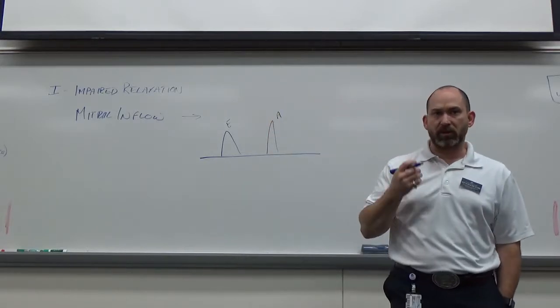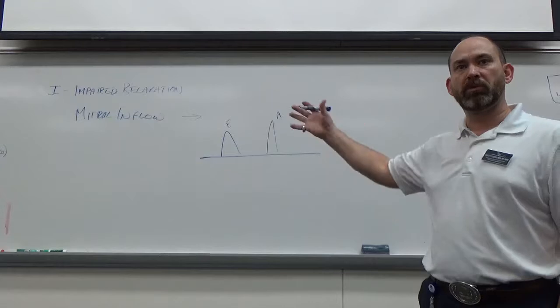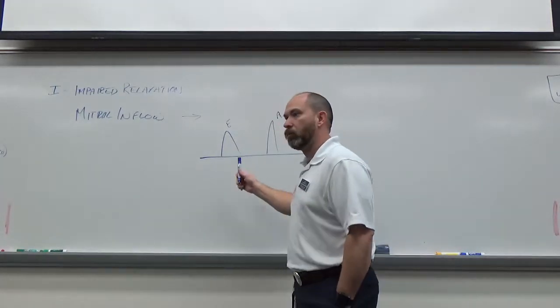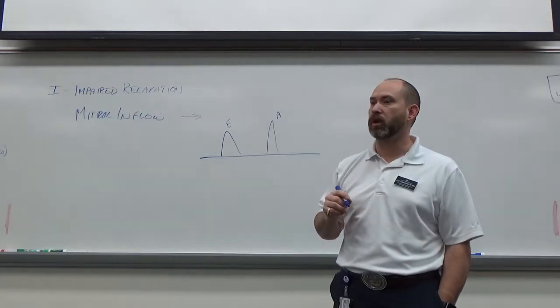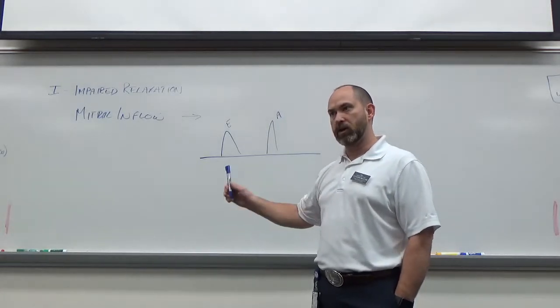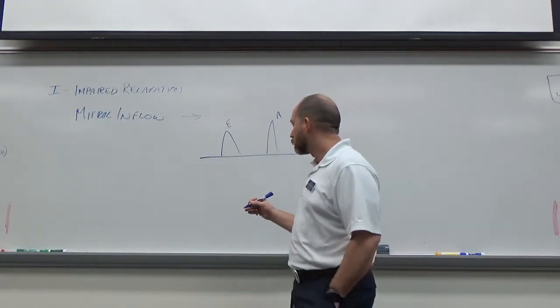And just to emphasize it, because when we get into these abnormal patterns, our inkling is to do what first? When we see just two waveforms, we usually take the biggest as the E wave, right? Because we want it to be normal. Okay, so what EKG wave does this correlate with? Or which ones can you locate to see where we're at? Okay, so R wave is systole. So E wave starts in systole? Starts in diastole, right? So what should it follow? The mid-T. Okay, so the end of the T wave.